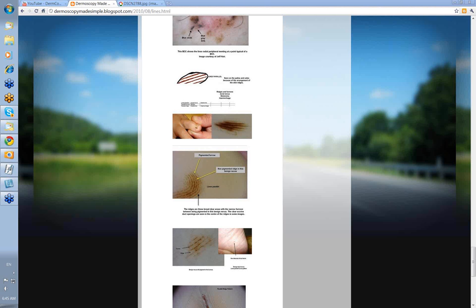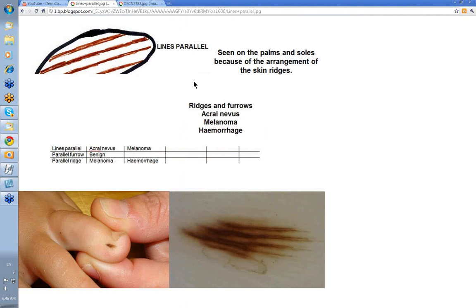Hello, my name is Ian McCall and this is a video from the Dermoscopy Made Simple series on lines parallel. Lines parallel are seen on the palms of the hands and the soles of the feet. This parallel distribution of pigmentation is related to the ridges and furrows — the dermatoglyphics — that you see on the palms and soles, and the arrangement of the keratin is unique to these areas.